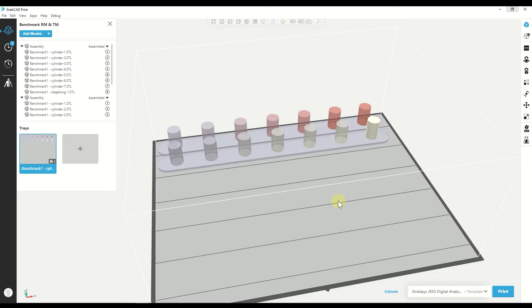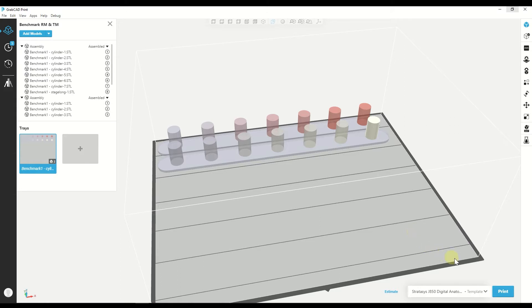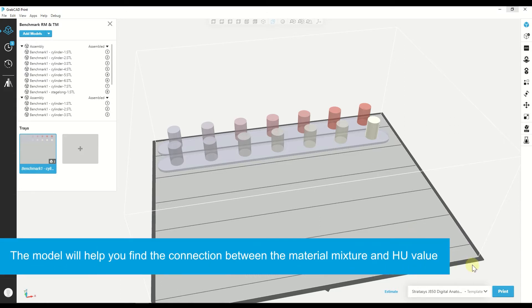We recommend you to print and scan this model when you first use the Radiology family in order to create an approximately linear equation that demonstrates this connection. Based on this model, you can make an assumption of the Hounsfield value that you want and find the material mixture that can give you that.